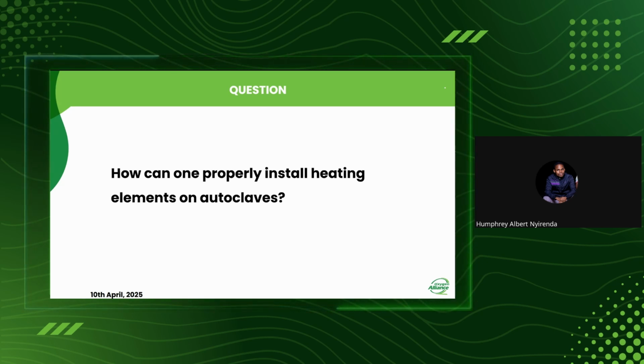But with the delta, you just use the live wires only. Each side of an element receives a phase, not from the same phase, but from different phases.